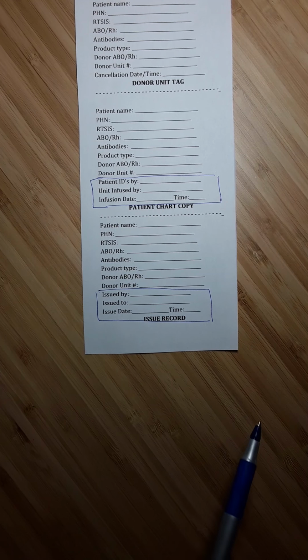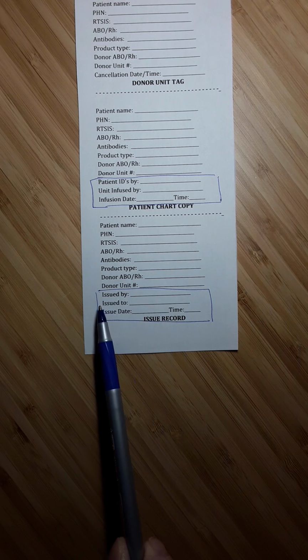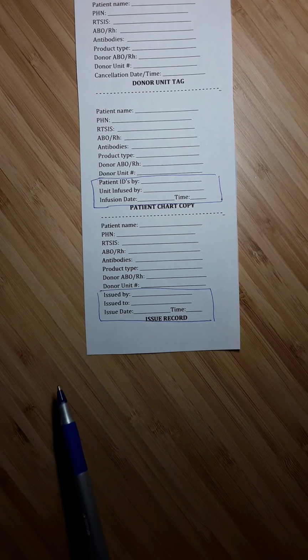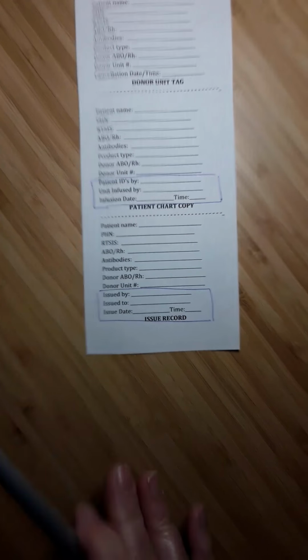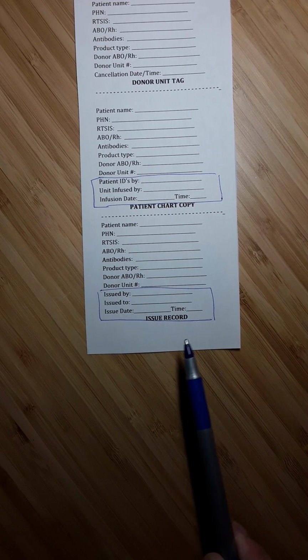You'll call a porter, or the patient care unit may call a porter for you, but a porter or someone will show up in your blood bank to get the unit of blood for the patient. They'll usually show you some ID. And then what you'll do is they will end up signing here where it says issued to and the issue date and time. The issued by is the tech that is physically handing the blood to the porter or the nurse, the doctor, the anesthesiologist, whoever it is that comes to get the unit of blood. Okay, so issued by is me if I'm giving out this unit of blood. Issued to is the person picking it up, and then they put the date and time.